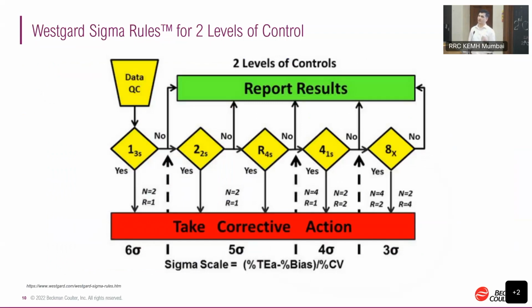In the standard Westgard rules, there is something different. You will see 2S in that rule as well, and you will not see the sigma mapping at the bottom in the standard rule. In recent years, I think in 2015, Dr. Westgard has incorporated sigma into quality control rules.